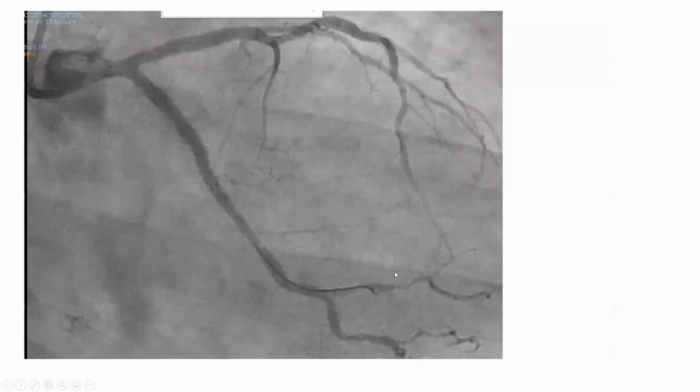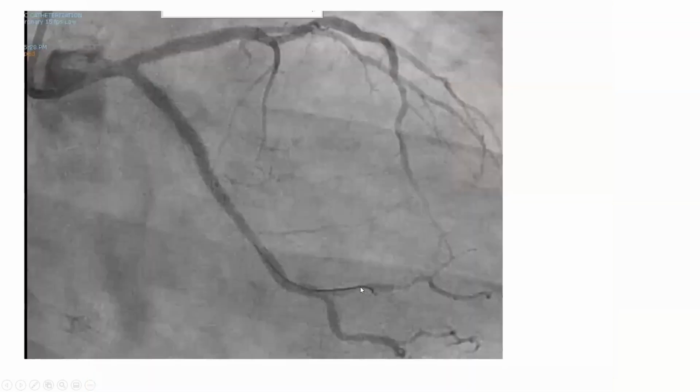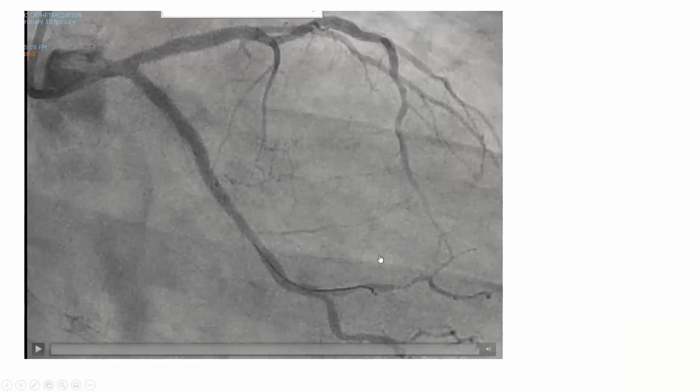So here, I did not use laser because, like I said, it has no clear established value for in-stent tissue growth. Therefore, in Europe, the best treatment for this 2-layer stent is to put DCB. In the US, what I did is I just used a standard balloon and then cutting balloon. Another option in the US would be brachytherapy, but I don't have it available at my center. So that's the only thing we used here.